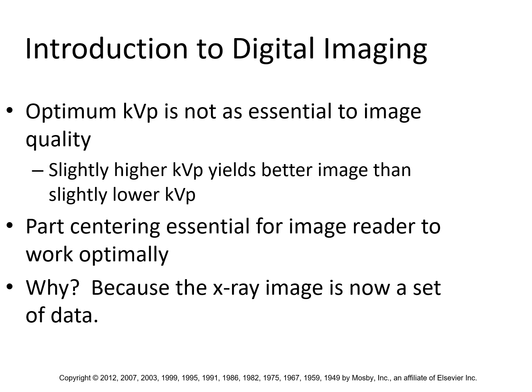So we can actually reduce and eliminate a lot of the scatter that deposits in the raw data. Okay. And before it becomes the final displayed image, we can reduce some of that randomness in the image. Okay?